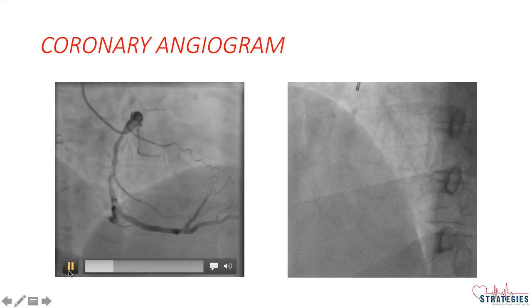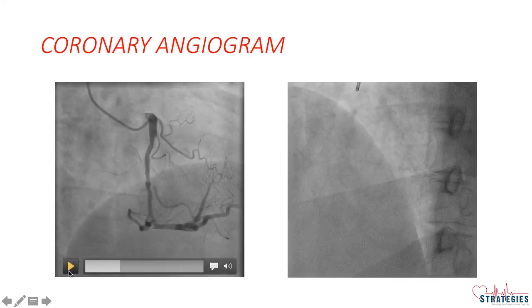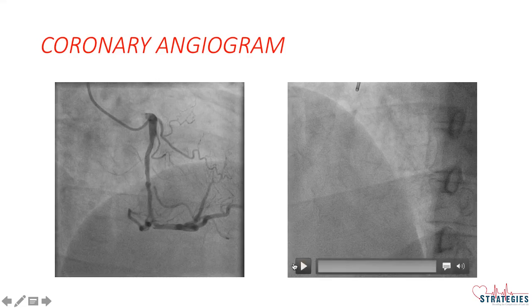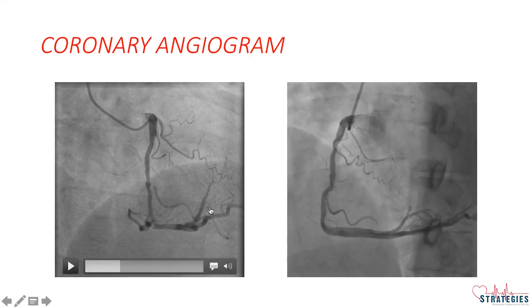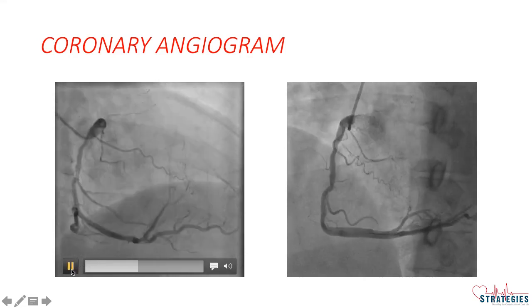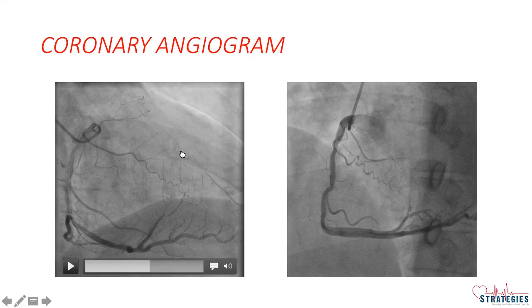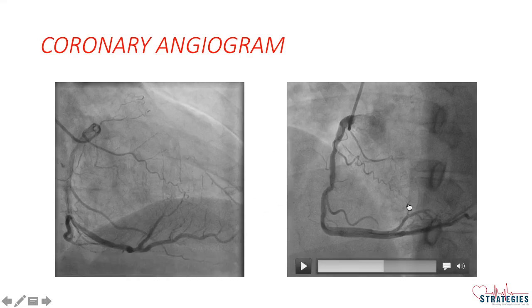RCA injection showed an intermediate lesion in the middle of the RCA, giving a good collateral to the left system which is filling distal LAD.